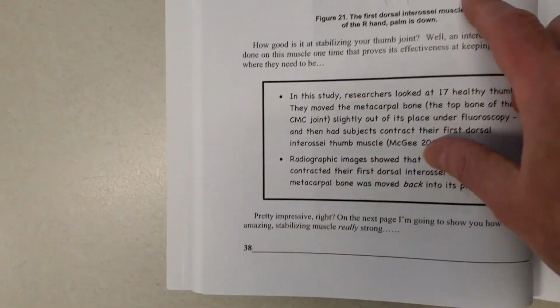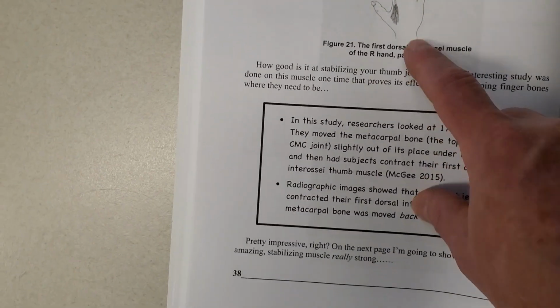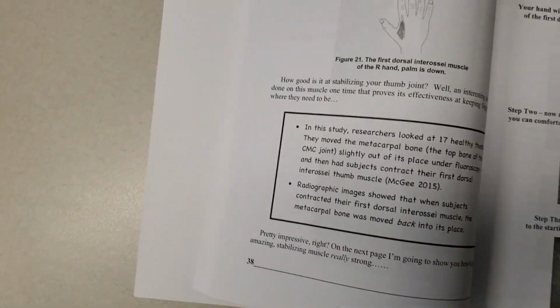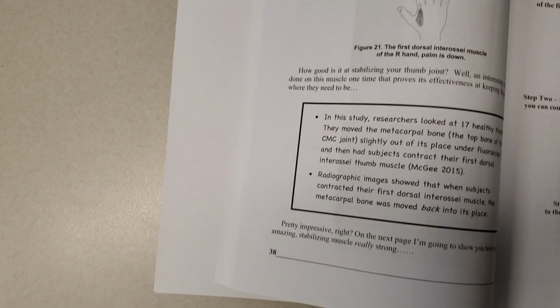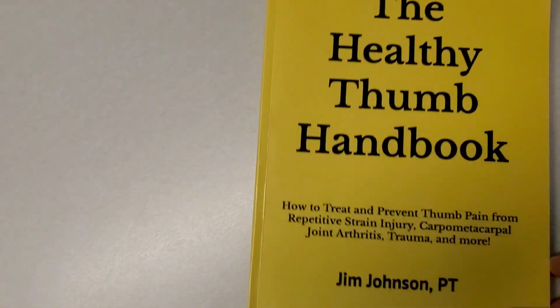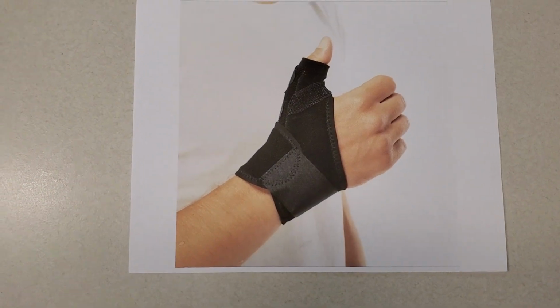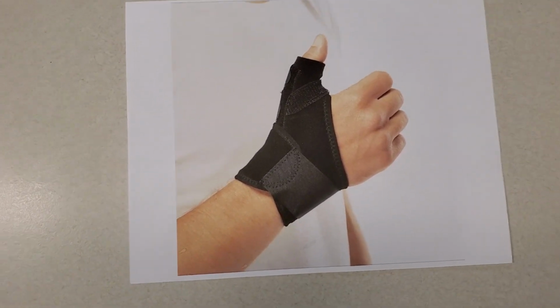The other one is your first dorsal interossei muscle. This is another key muscle that attaches to the base of the joint. Really crucial that you strengthen these two muscles. You can avoid a lot of problems. But yeah, there's actually a lot you can do for thumb arthritis if you know what to do. Good resource. If you're looking for some good external stability, this is a real simple brace. I really like it, so check it out.